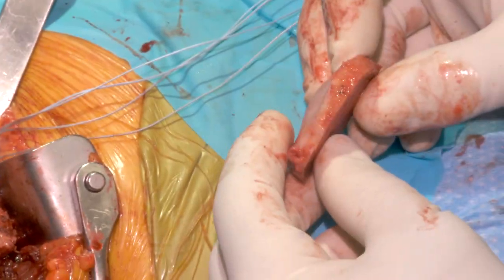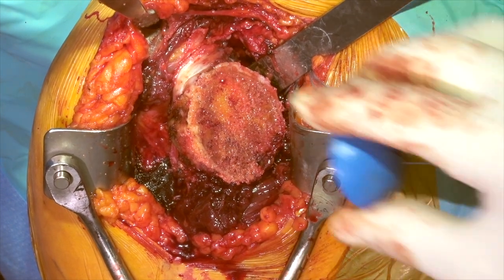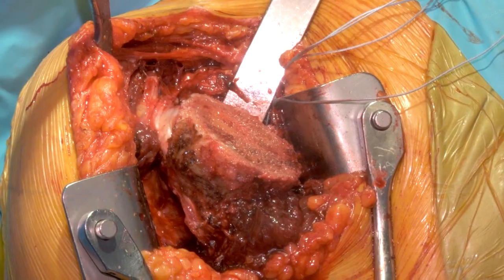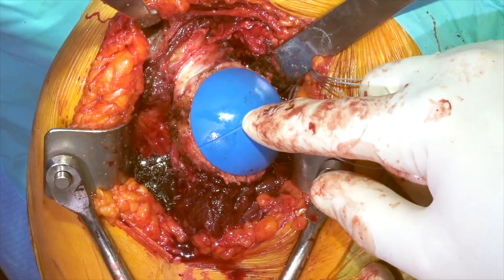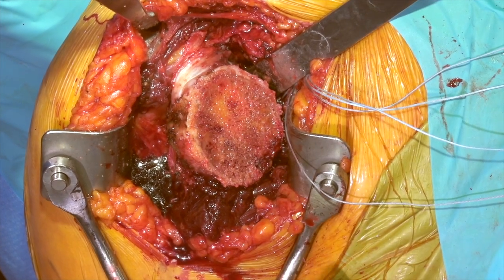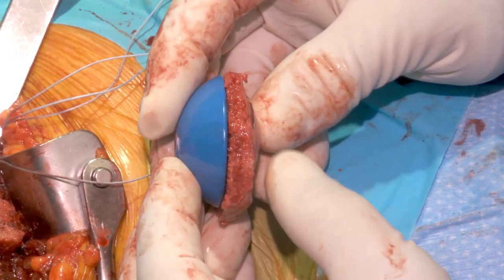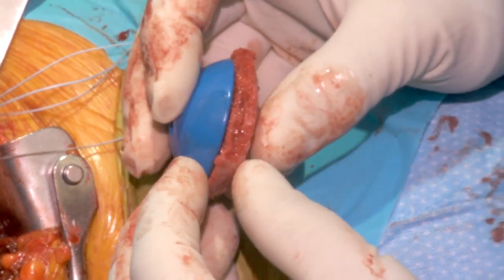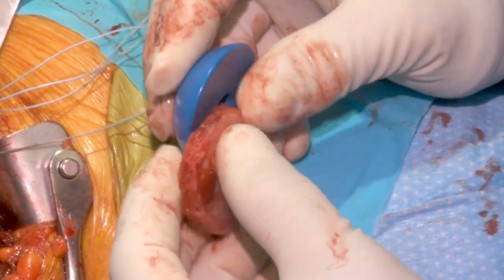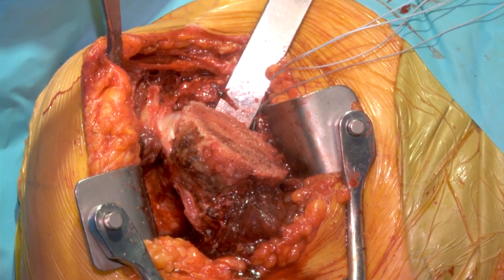You can use the excised head to help match up with your sizing, but it can be deformed and irregular, so the more consistent measurement is directly off your cut surface. We'll try the 44 in place, then take a 46 and see if that looks any better. Looking at this, the 46 is the better match for this patient. You can see how the patient's humeral head matches up on the cut surface, but notice the deformity — the ears are flattened. The humeral head has a fixed relationship between head height and radius of curvature of 0.75, so if that is your diameter, that should be your height, matching the patient's normal anatomy.